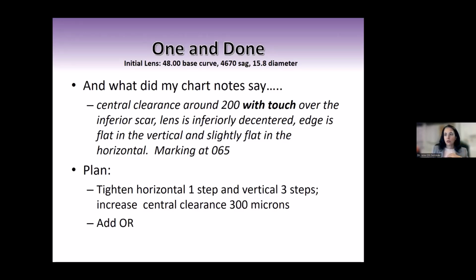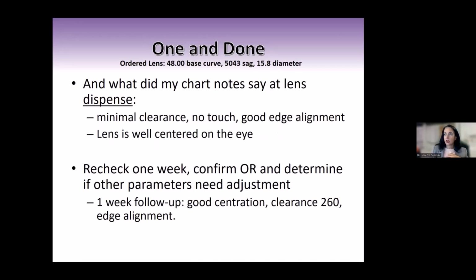Then we added in our over-refraction. Okay, so now here's our new lens. So we ordered that same base curve. We've got increased sagittal depth to get that increased central clearance, same diameter.